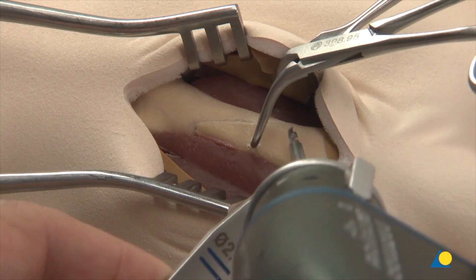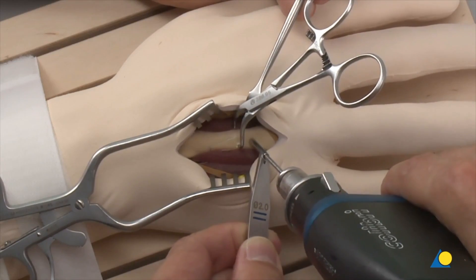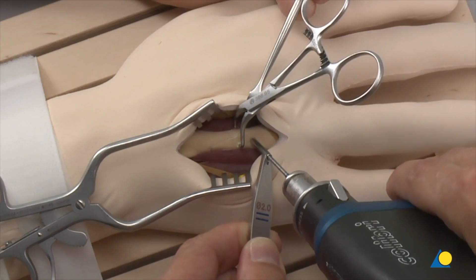The 2.0 mm double drill sleeve is placed on the metacarpal and the gliding hole is drilled with the 2.0 mm drill bit.